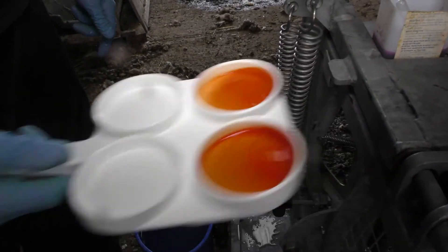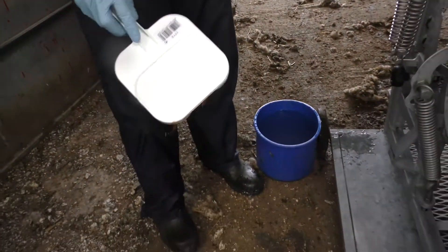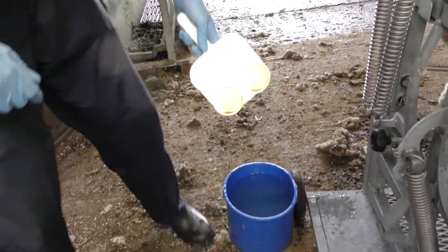Once you're sure of the score just tip it away. And then rinse thoroughly.